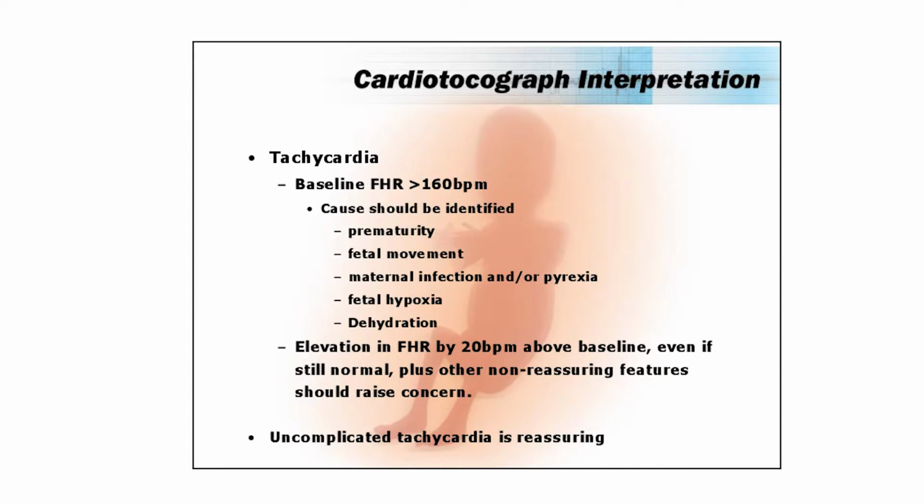How many of you will be happy with a baseline fetal heart rate of 110 on that baby? No, nobody's happy. What did you just say the normal fetal heart rate was? But you'd be happy with the baseline of 170? What did you say the normal was? So you were unhappy with a normal baseline rate, and you were happy with an abnormal one. And that answers, and I agree with you, the challenge you asked earlier on.